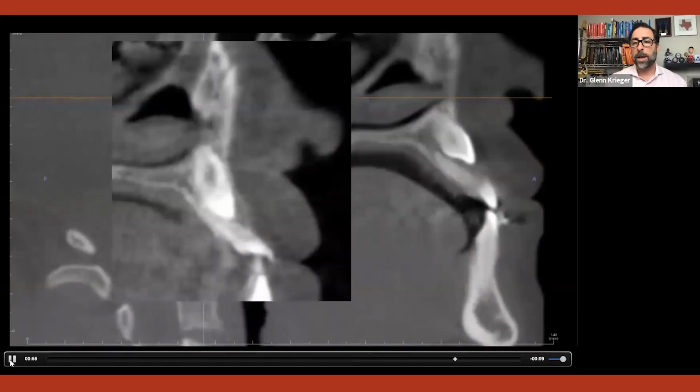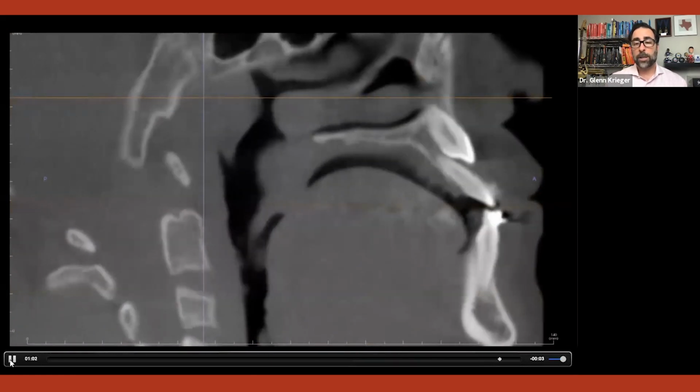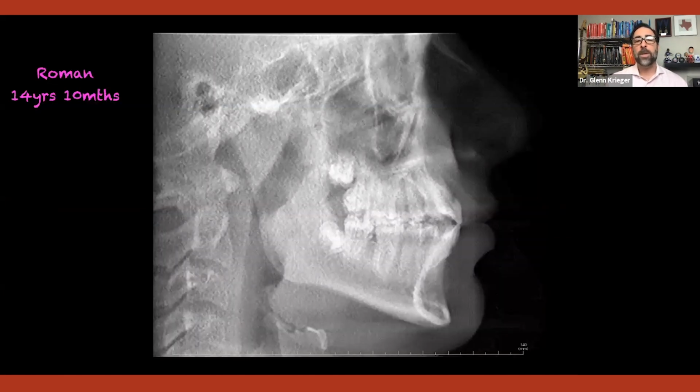Look at what I've got from that cuspid to lateral incisor root. I have room now. Not a ton, but I certainly have room that I didn't have there before. And that's where CBCT is really helping me with him. So again, we're almost getting there. Just got a couple of more cases.